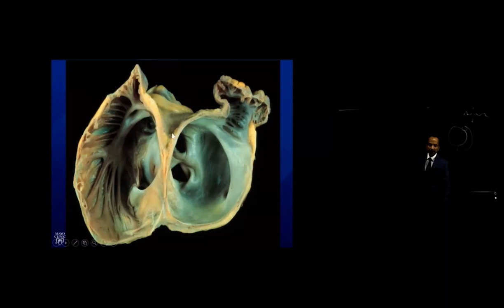So non-coronary sinus of Valsalva will be right here. That's why perimitral tachycardias, sometimes we ablate from the non-coronary sinus. That's not so much collateral damage, but a collateral structure we have to just think about and remind ourselves is located in that region. The sinus node artery, when it comes from the circumflex, will traverse right over here.